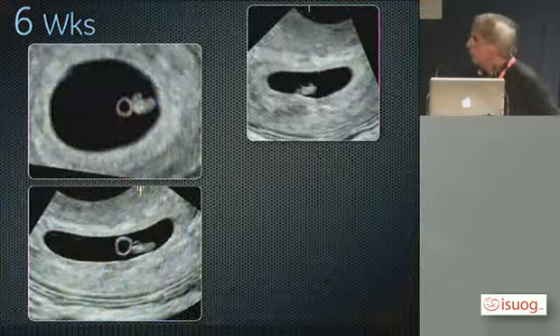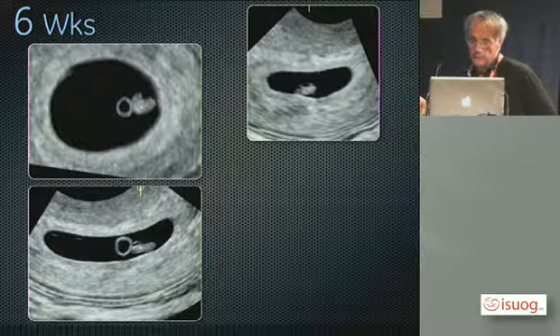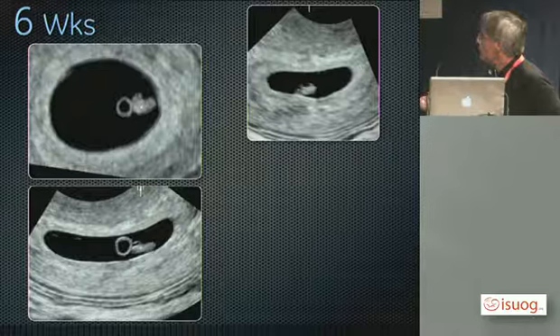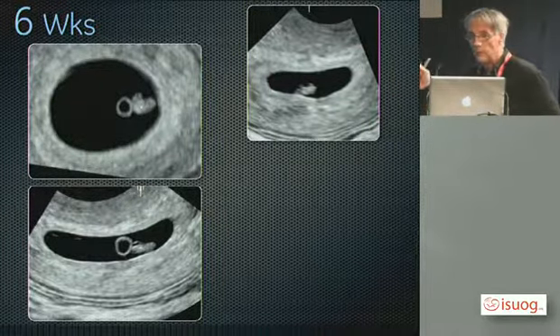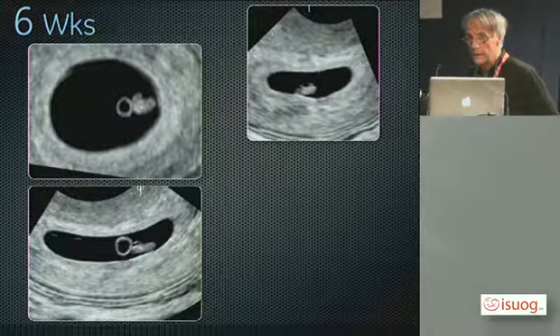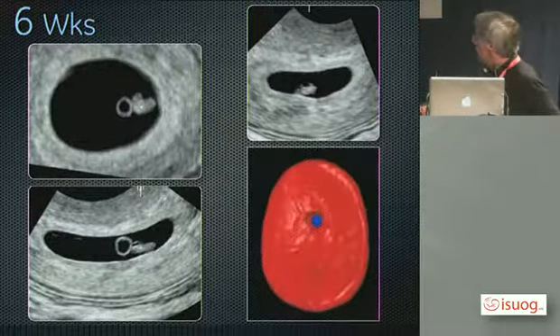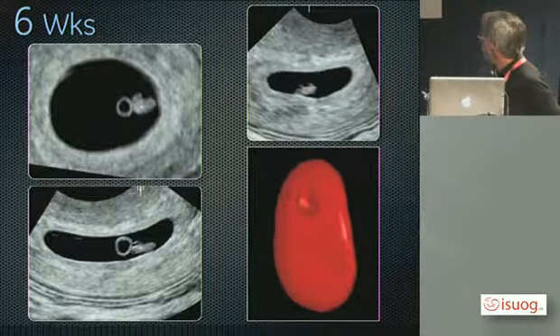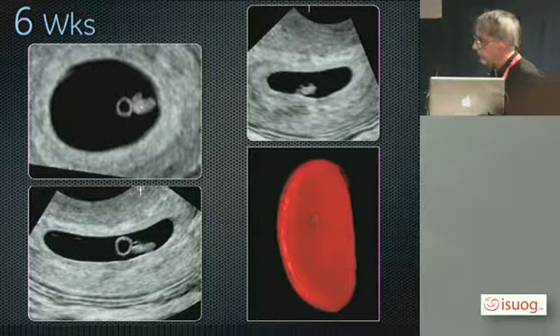If you want to do measurement of the gestational sac in the early stage of pregnancy, I never use it because, in my opinion, it's not useful. You can see these 3 gestational sacs. Which one is the biggest? Maybe this one, but not, because it's only the same gestational sac in 3 orthogonal planes. So the size depends on the section. A gestational sac is not a sphere. It's flat, like this. So it depends if you do this measurement or this one, it is completely different.